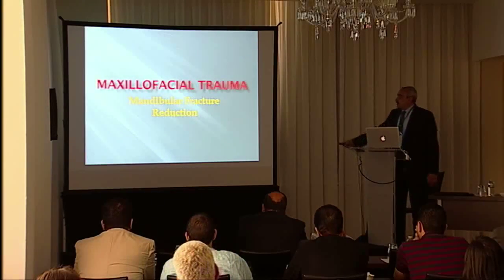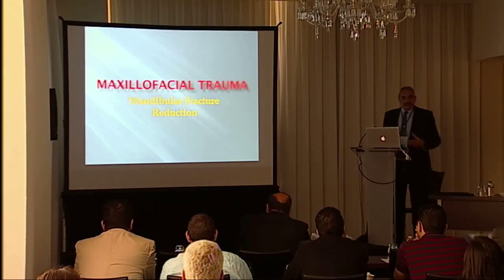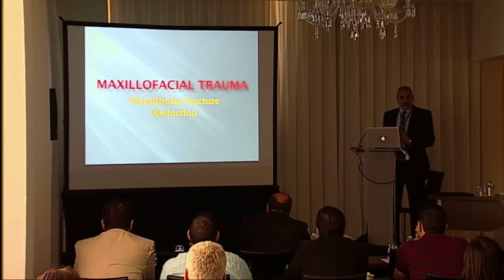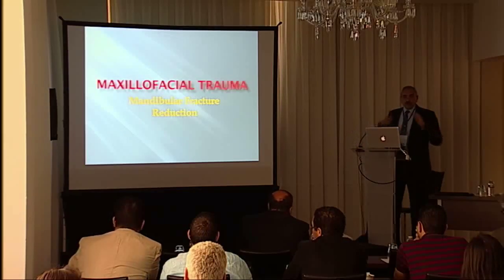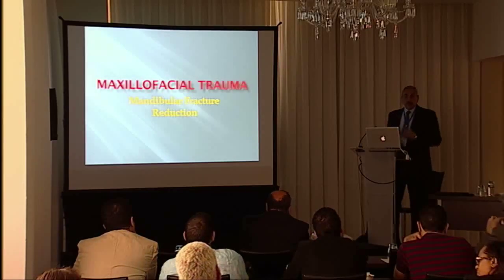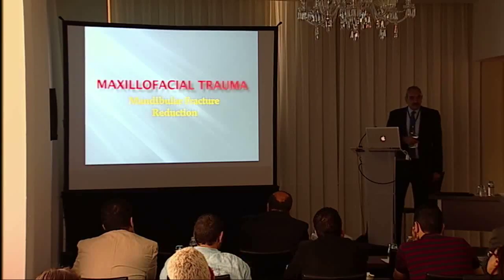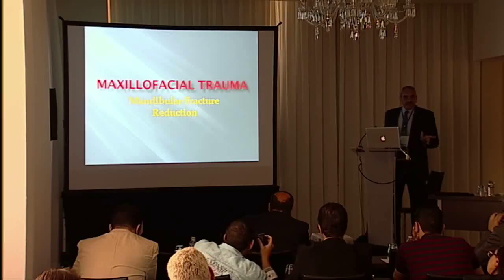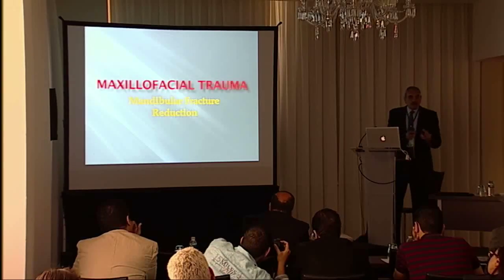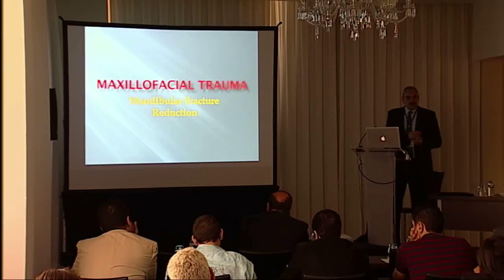For mandibular fracture reduction, sometimes we have a mandible that is broken, but the patient does not have enough teeth to fix the occlusion together in order to have what we call maxillomandibular fixation, to fix the mandible with closed methods, or we cut him open and fix it with bone plates and screws. Sometimes we do not have enough teeth to do that, so we do it manually, and we end up with small disturbances in the bite, and we say, okay, no problem, the denture would correct that.